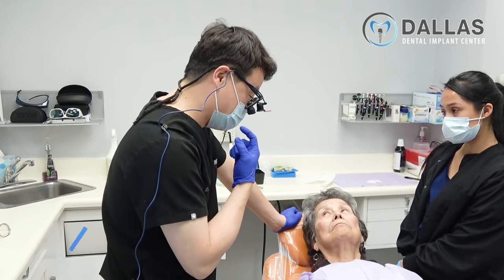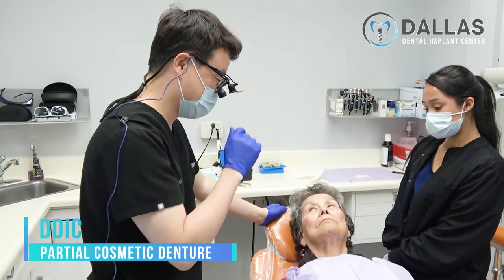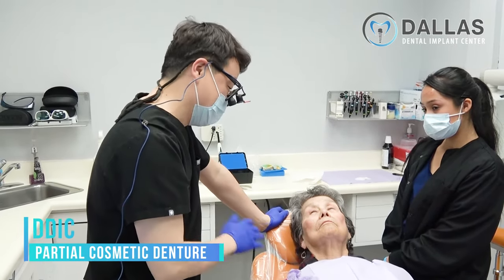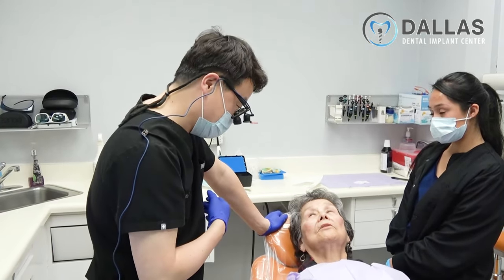And then just practice with Crystal to take it out and put it back in together. If you can successfully do it yourself, like you're doing with your lower, you're good to go. Okay. You feel comfortable? Yep. Very good.